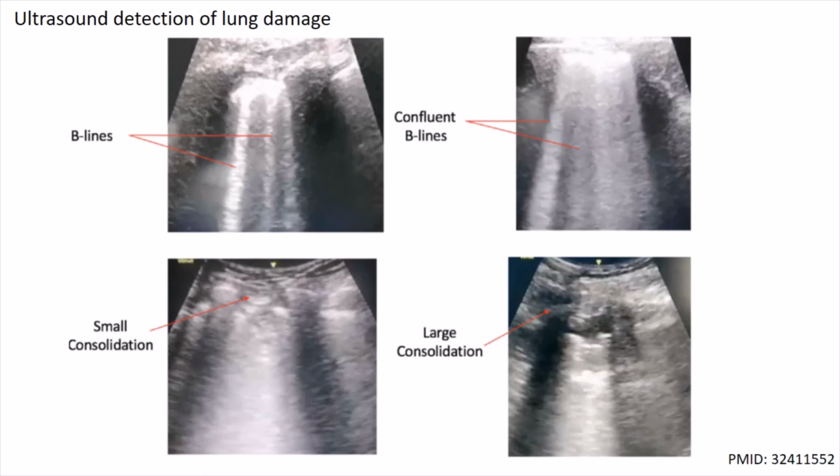Although most of the patients completely recovered from the disease, they are likely to have some kind of long-term lung damage. Only time will reveal the magnitude of irreversible parenchymal lung injury. Radiological findings are very helpful in predicting the clinical course of the disease and may be used to monitor long-term consequences. In conclusion, as the pandemic progresses, the medical community will frequently rely on portable chest X-ray and ultrasonography due to its widespread availability and reduced infection control issues that currently limit CT utilization.